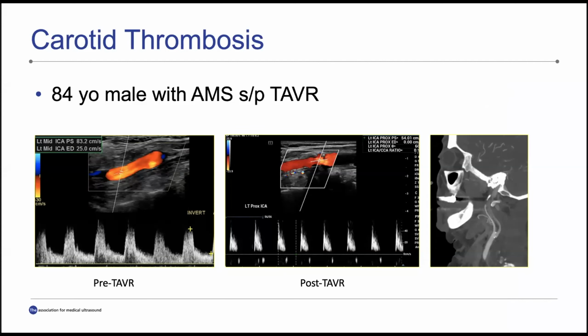Now, it's important to utilize carotid Doppler in some of these cases. They can be extremely helpful. Here's an example of how the change in the flow pattern can be extremely helpful when there's abnormalities to the vascular system that you may not pick up routinely.